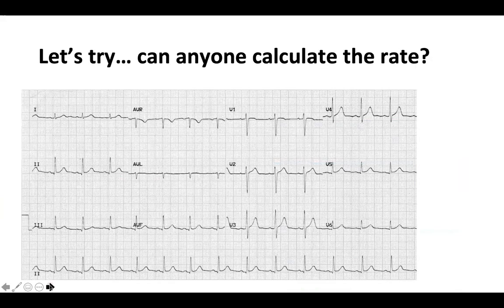Okay, so can anyone try and calculate the rate here? You can just put your answer into the chat. So tell me what method you'll be using and your answer. My pointer is just not working now.